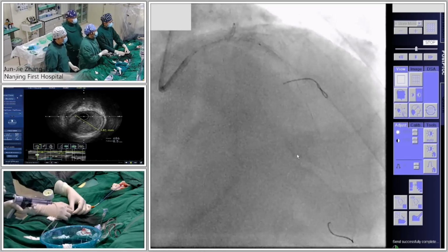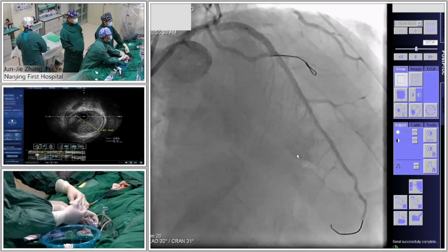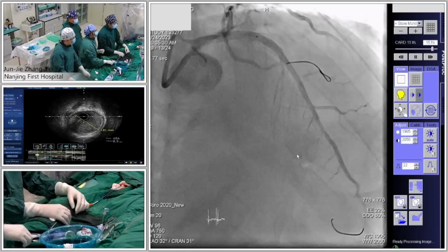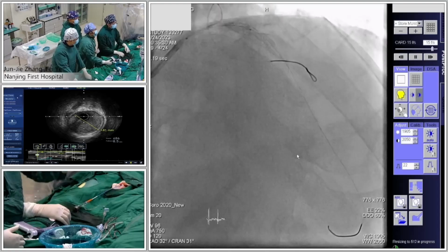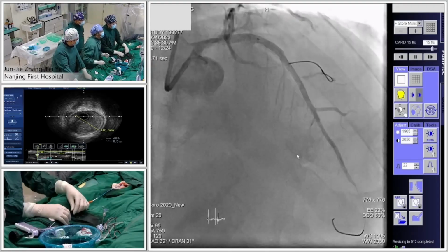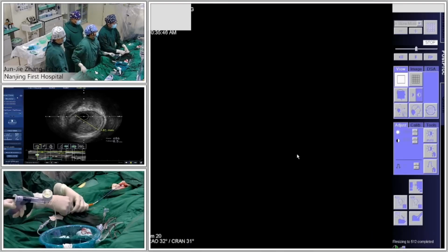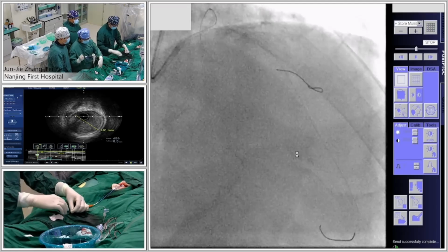See it? Fine. Okay, done. Oh, it looks like we lost the diagonal. No, seemingly still there. Still there. Maybe give some nitro. The patient has no symptoms. We can check the spider view.